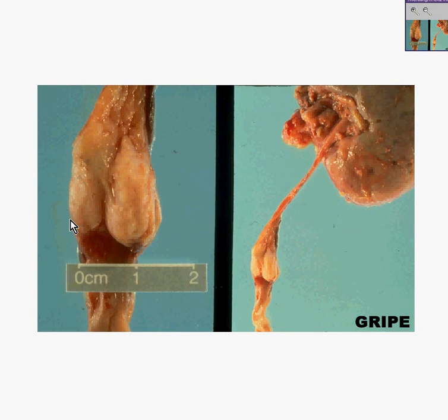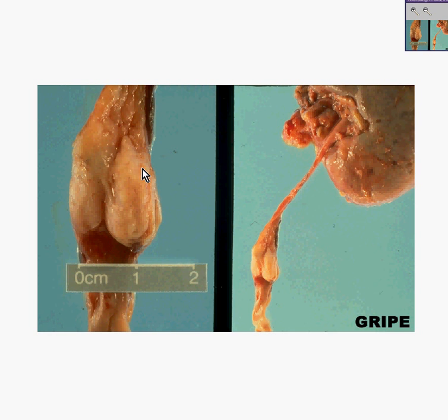You may recognize this as being a ureter, but if you didn't, if you look at it over here, you can see it's connected to the kidney and coming out of the renal pelvis. So this is a ureter that's been opened up. Here is the mucosa here in the lumen, and here is the mucosa here. Notice that there is perhaps a 1 to 2 centimeter tumor that appears to significantly encompass, perhaps obstruct, perhaps not, the ureter — and this is our tumor in question.